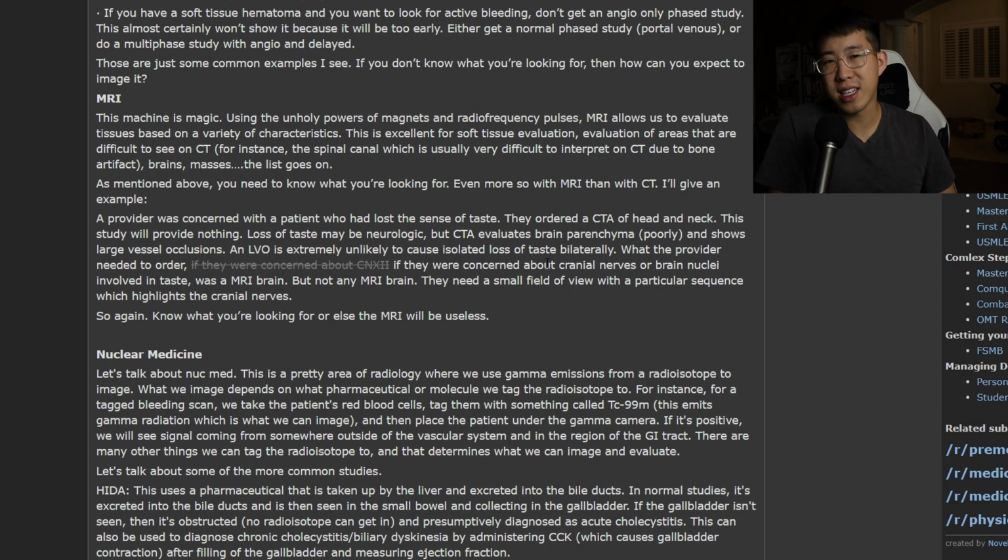Another thing for MRIs that is really important is looking into the pacemakers that they might have and if they're MRI compatible. The main way to actually confirm this is really to just look up the brand of their pacemaker and then go to the brand's website and find the contact information there. And then you can just call the on-call representative, and they will tell you if it's MRI compatible, and if so, if they need specific MRI protocols to be done, they will write that all down for you, or they will tell the MRI technician and get that all sorted out for you.